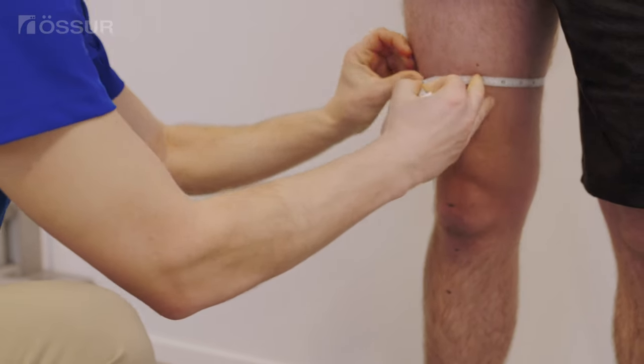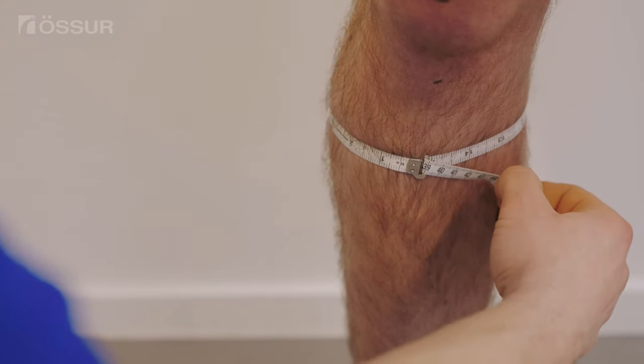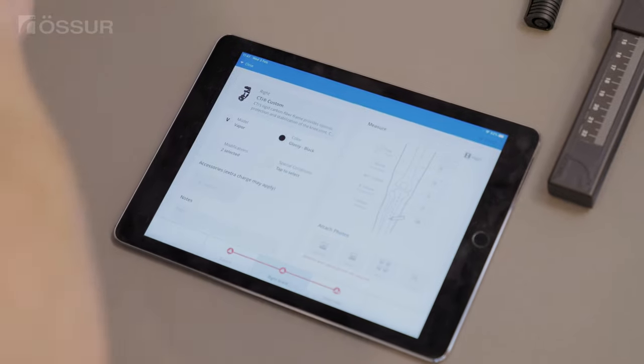Take the circumference measurements with a soft measuring tape. Record all measurements directly in the smart measure app.